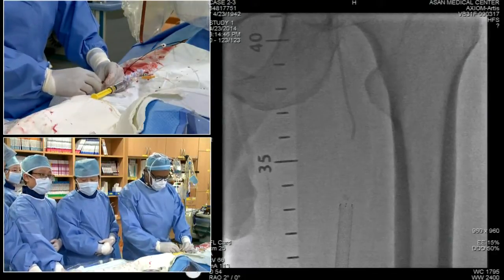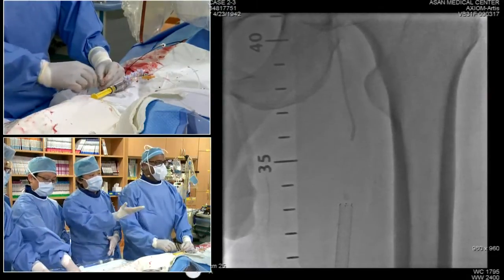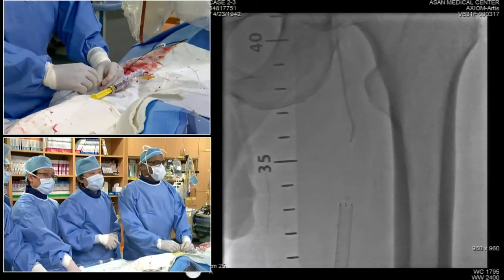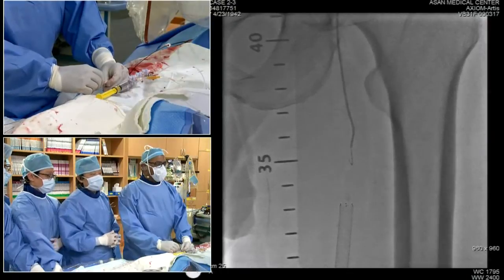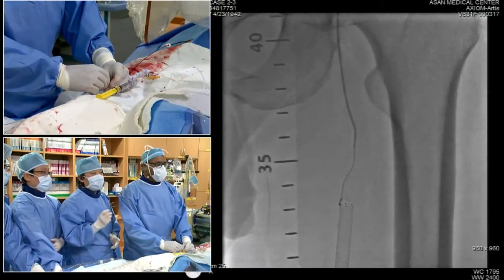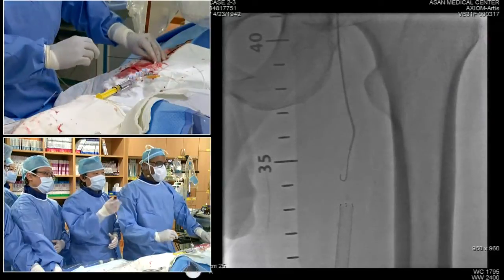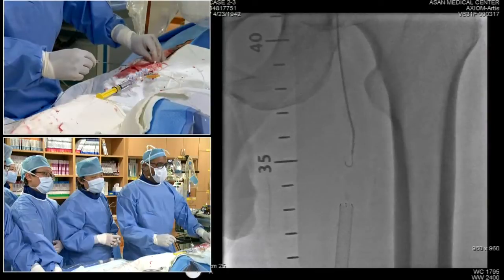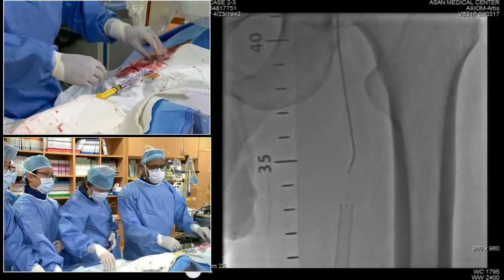Doctor, can you hear me? We hear you very well. In your practice, at this point, what do you do? In my practice, at this point, I usually use a CTO dedicated stiff wire. So I usually try to actively get into the intrastent space. So you tell me then, what do you think? We were just having that discussion.